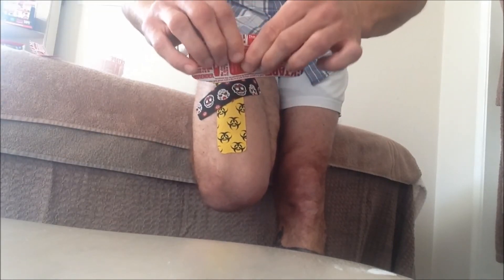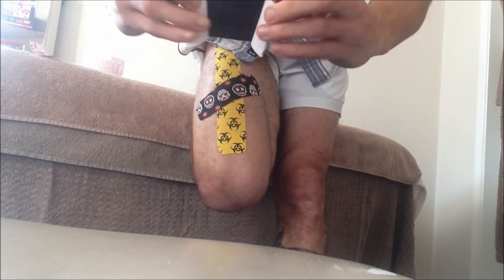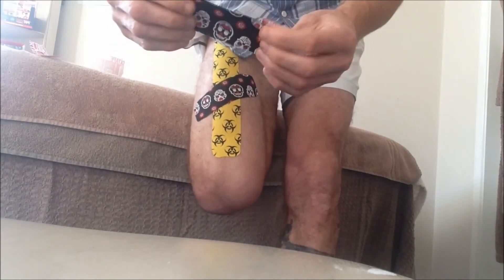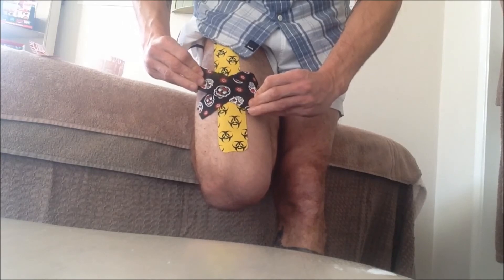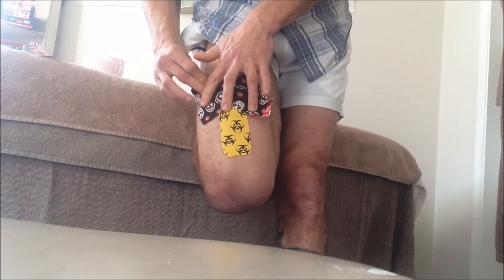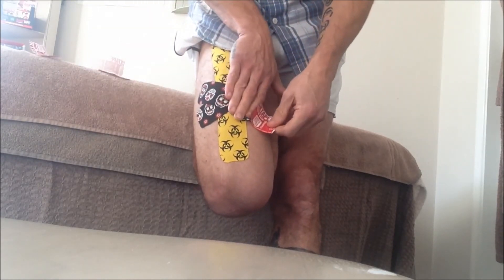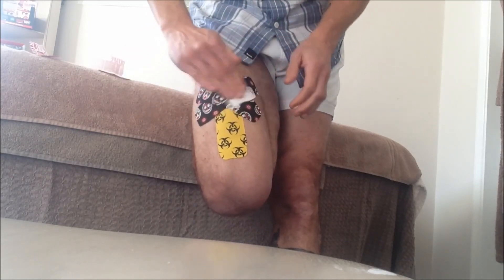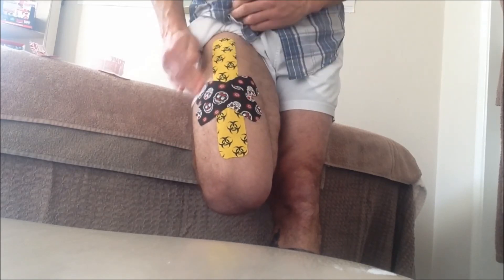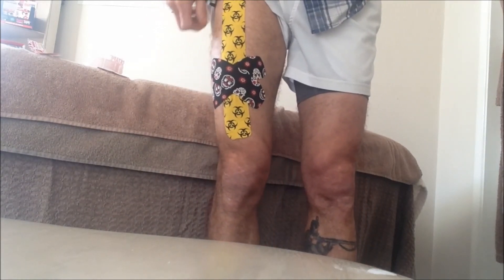Then we rip the third piece in the same manner — straight down the middle, a little tug to break the backing. Peel the backing back and again apply at 75% to 100% stretch, so we're putting a cross straight over the pain — laid on with stretch, then eased off with no stretch at the ends. Using the backing, heat-activate the glue again. That's the taping technique for rectus femoris muscle strain.